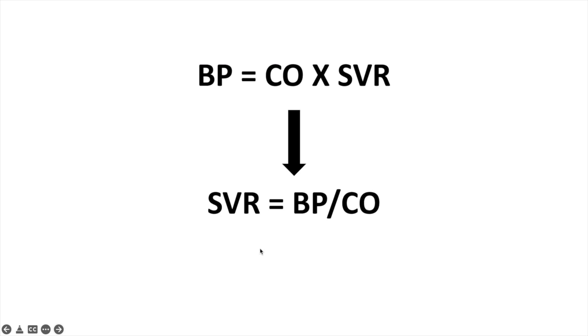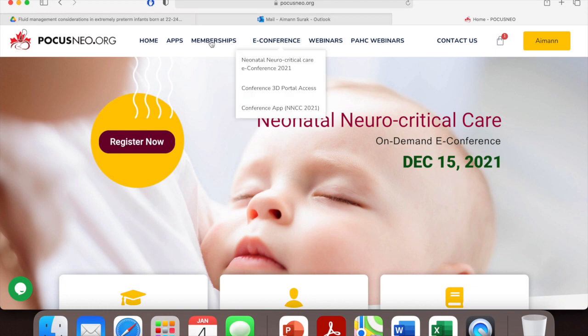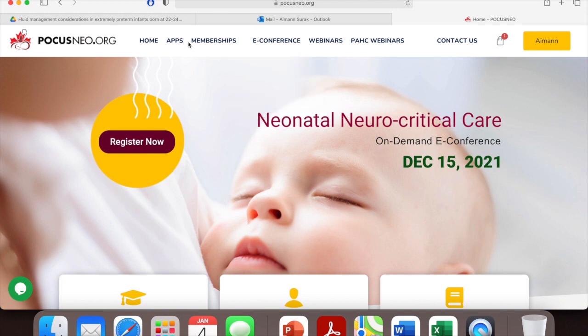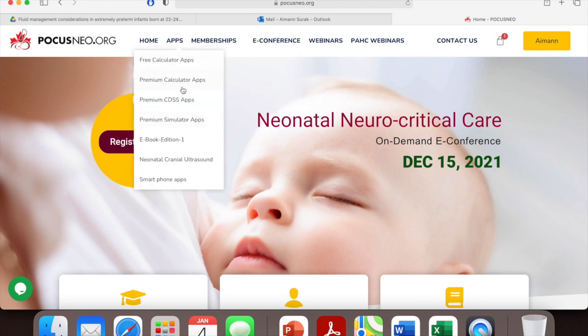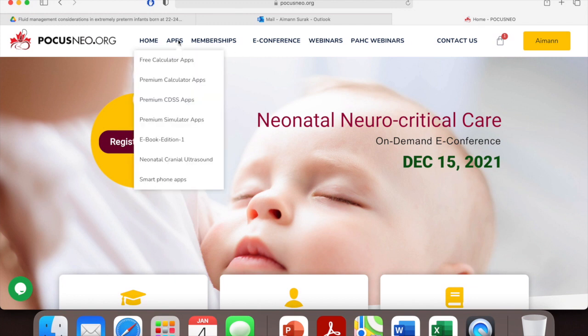For example, I'm going to show you a website that I use, which is focusneo.org. You do need a membership subscription to access their apps. There are some free apps, but to calculate the SVR you need a membership access.